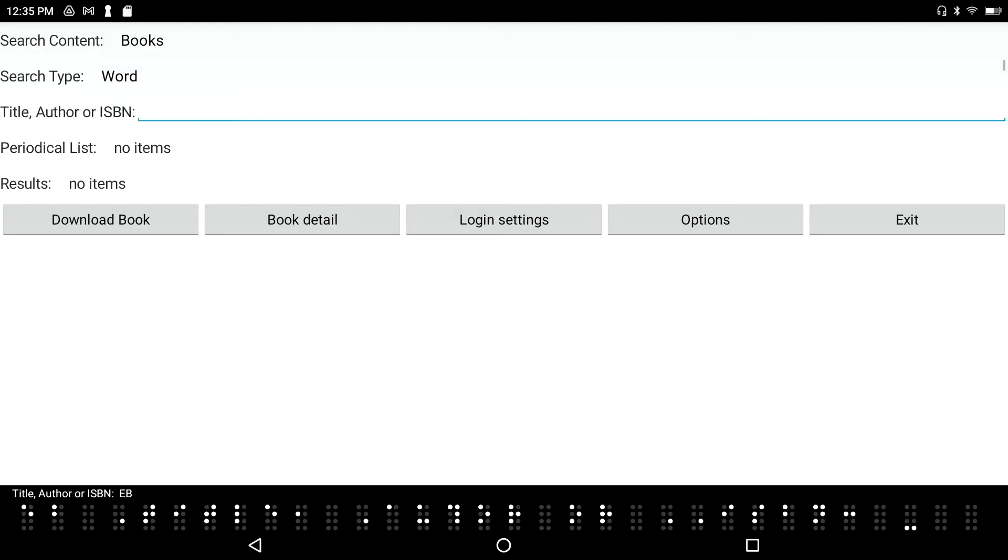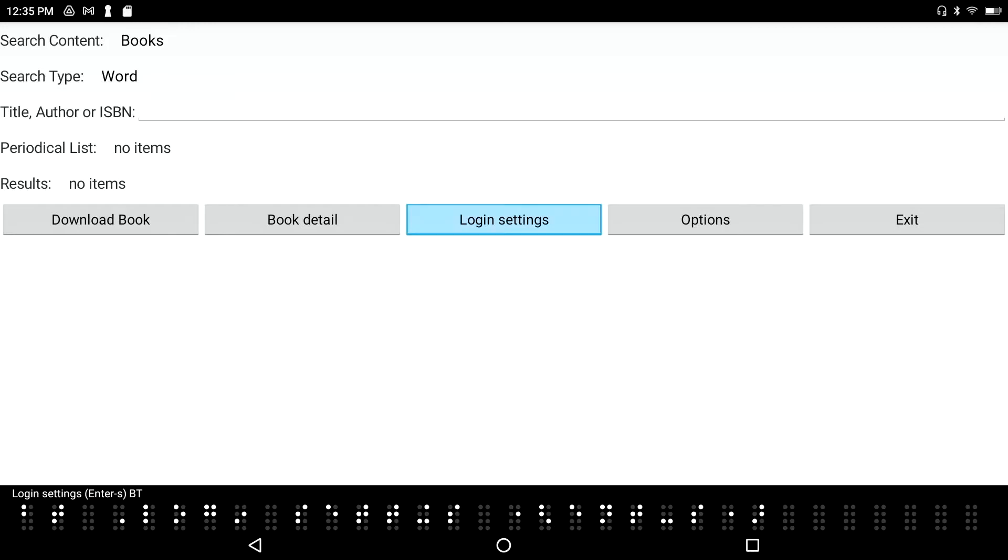Tab again - title, author, or ISBN edit box. This is where I would type in my title or my author. Let's just go ahead and tab through here a little bit more. I've got login settings.